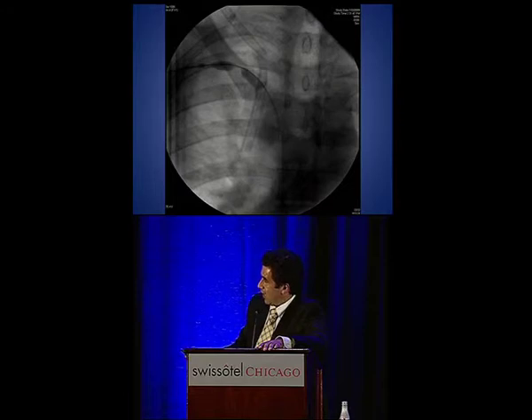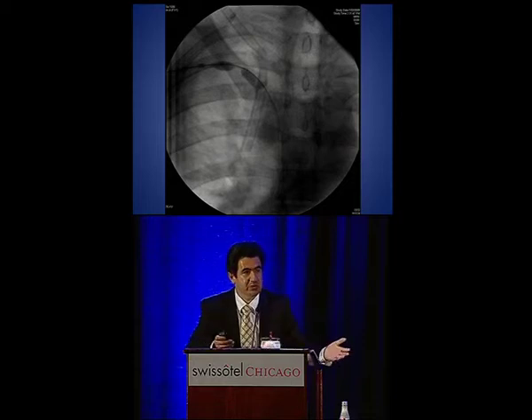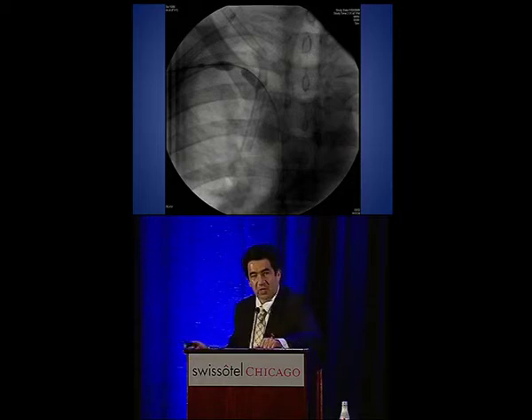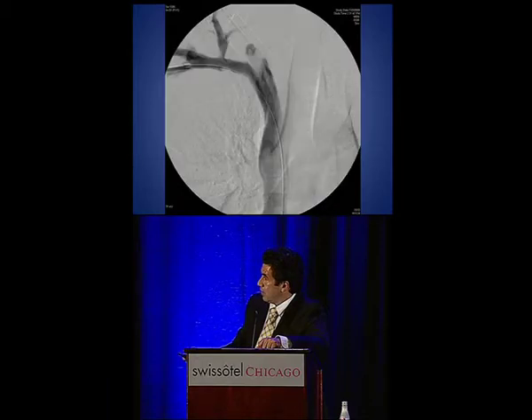This is a patient that had lysis followed by surgical decompression, and on postoperative day 2, he had swelling and symptoms again. Young guy, and he said, you know what, I know it's back. My arm feels just the way it felt 2 days ago. I felt resolution of the symptoms yesterday, but now I'm back. So we go to the angio suite. Indeed, we see a defect. We balloon it very aggressively. You can see the JP drain somewhere there. We get this beautiful result. High five, everybody. Let the patient go home.